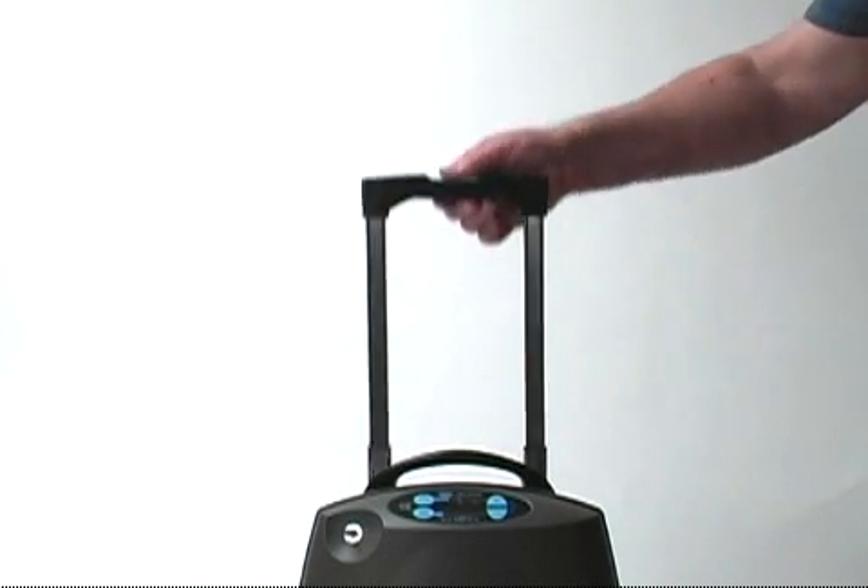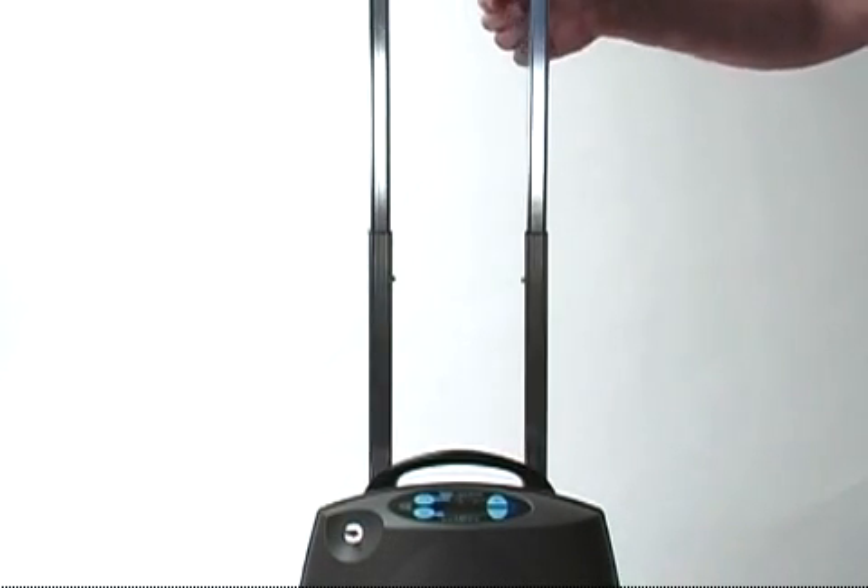Now you can press the push button on the cart handle to raise or lower the handle to a comfortable height.